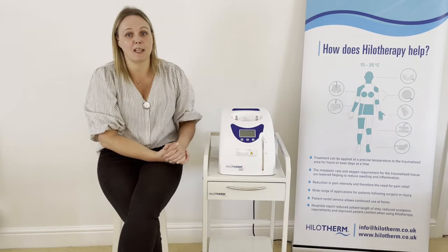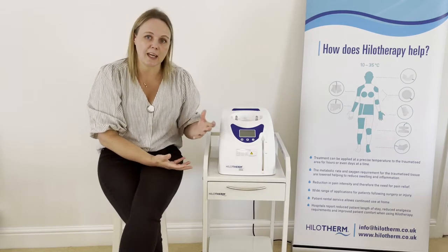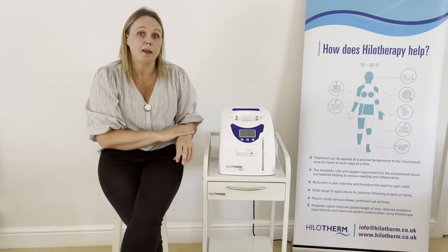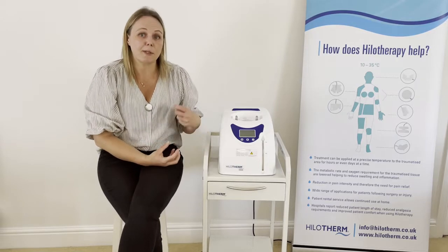For example, 18–19 degrees for facial surgery or 17–18 for knee surgery. Even at those temperatures, I would encourage you to try feeling the treatment at 17–18 degrees — most people are surprised at how cold that is, particularly when it's applied for long periods of time.